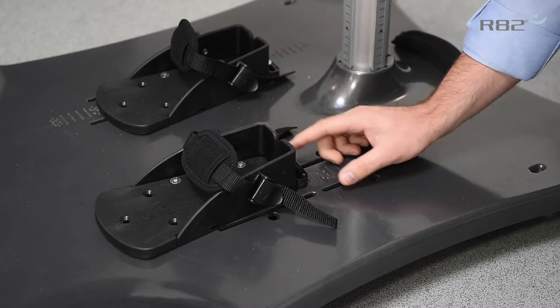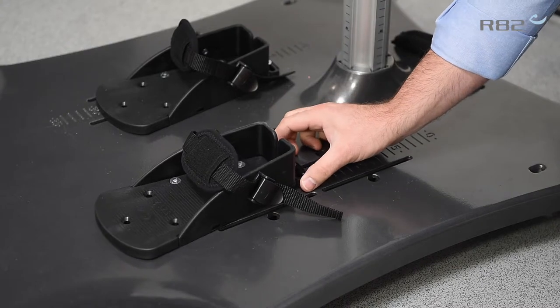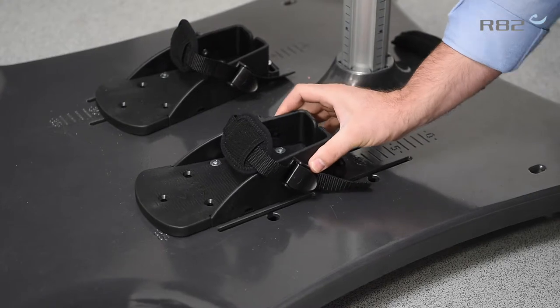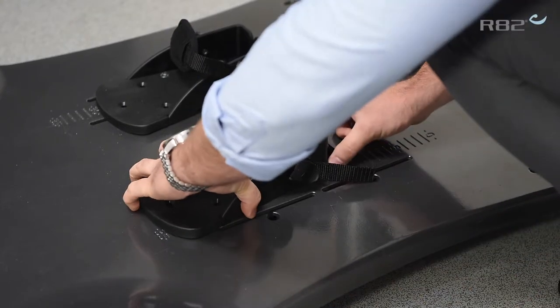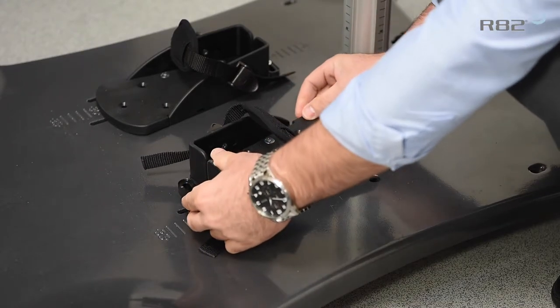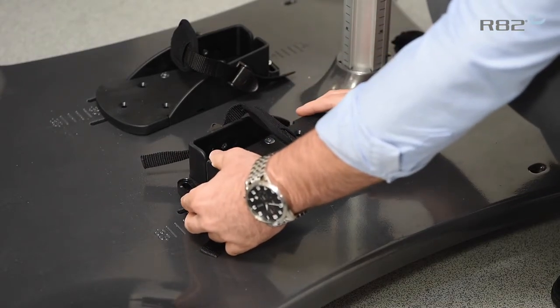The allen key adjustment at the back, which is a 5mm, allows you to rotate. You can also take the sandal completely off and then position it the other way if you're going to use the standing frame in an anterior position.